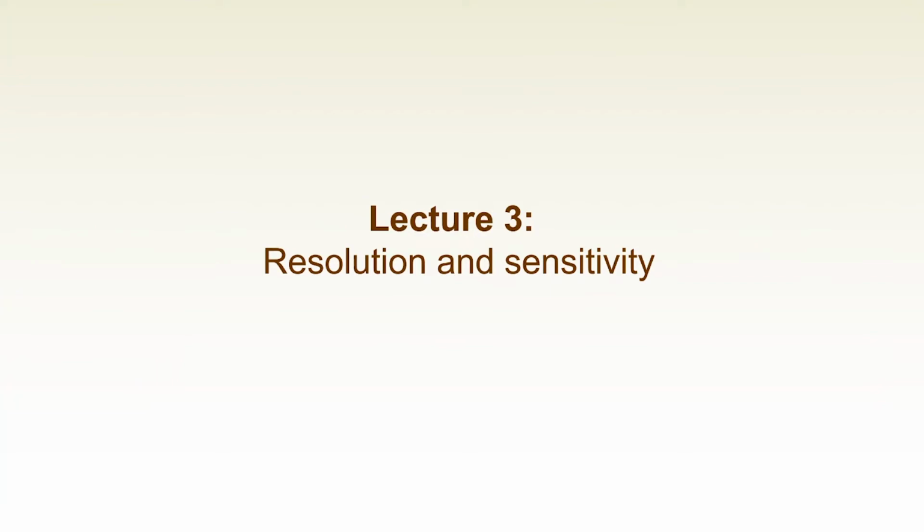Here, first, I'm going to talk about how we can think about the signal energy of the OCT. Then I will break down the signal-to-noise ratio into signal and noise. The noise is going to be broken down into 3 components: the shot noise, relative intensity noise, and also the detector noise. Then I'm going to talk about the signal-to-noise ratio, define the sensitivity, and see which properties the OCT sensitivity has.